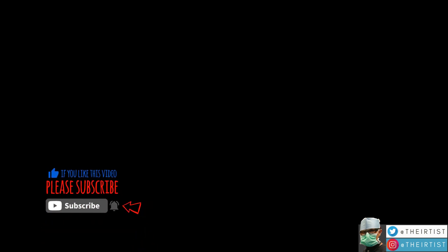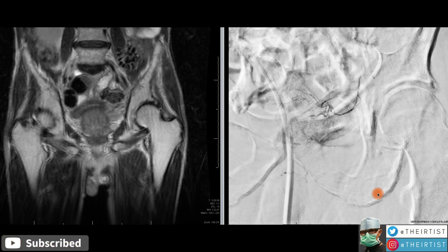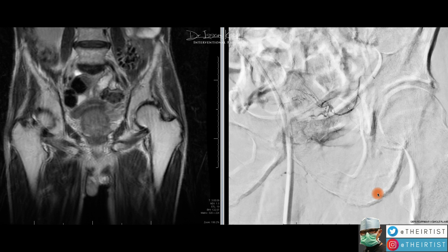Today we're looking at the effect of PAE, or prostate artery embolization, on only one side of the prostate, and we will compare it to the other side that was not treated. This is a view of an angiography during a PAE procedure.